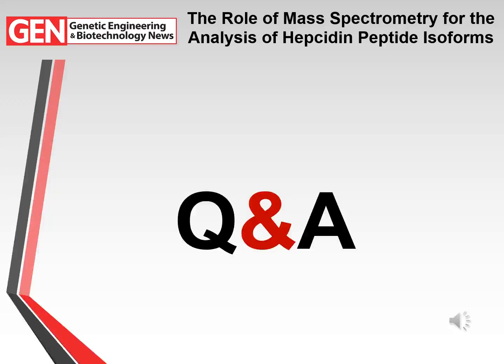And we need to be sure that we have global studies to show that we actually can get accurate data globally and that everything is harmonised, though that's maybe the wrong word. Basically we're on track and we know that I can run a sample anywhere in the world and they're going to get the same answer that I do, for those groups that actually do Hepcidin measurement.